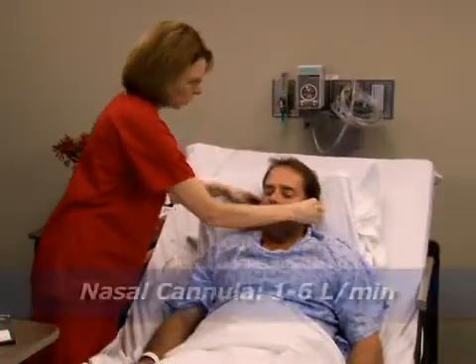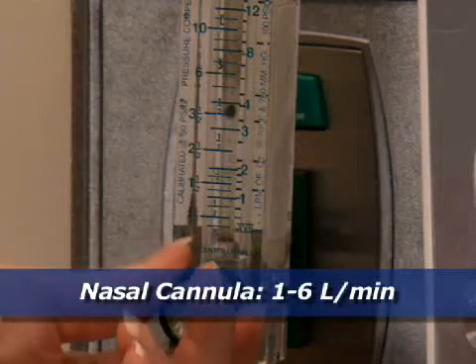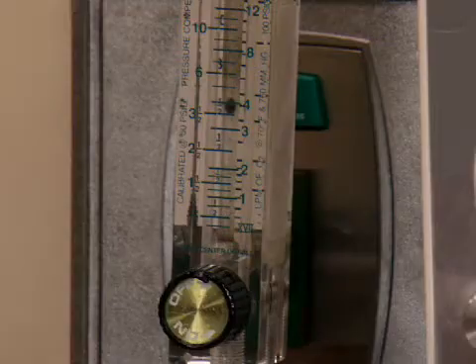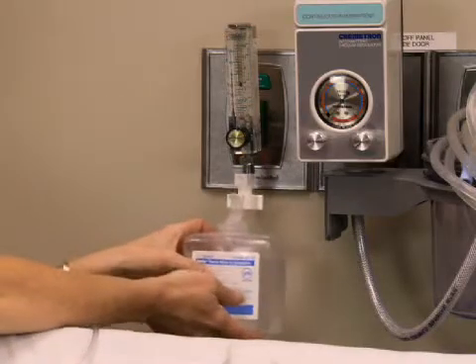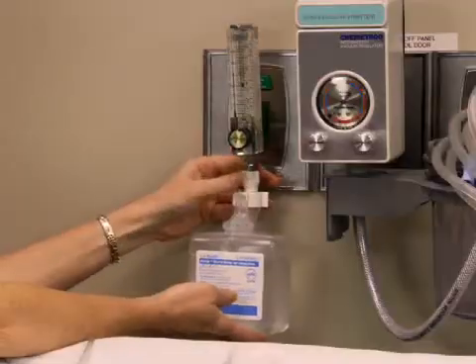For a patient who will have a nasal cannula, use a flow rate of 1 to 6 liters per minute, which delivers a fraction of inspired oxygen, or FiO2, of 24 to 45%. If the flow rate is 4 liters per minute or higher, add humidification and verify that water is bubbling in the humidifier.